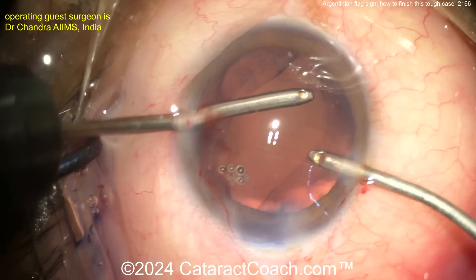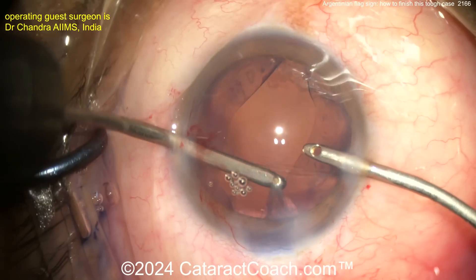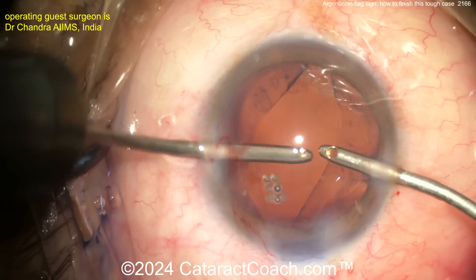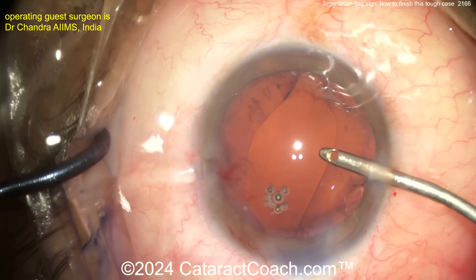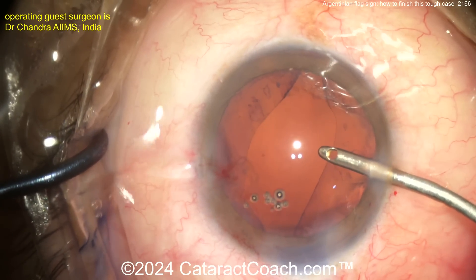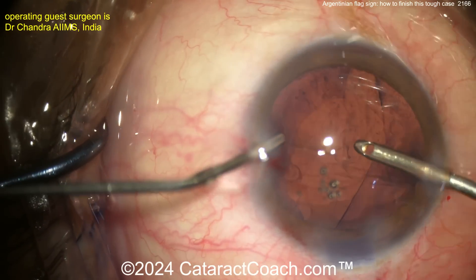It's not really near the posterior capsule. Now you've got to replace the viscoelastic unless you're going to do some sort of hydroimplantation. There's more cortex than I thought — more viscoelastic.